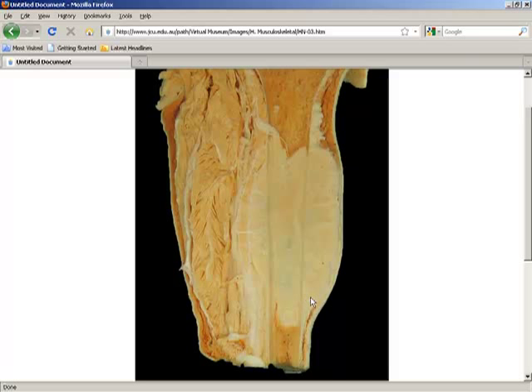Here the tumor is rounded, it's here, very difficult to differentiate, and below is the thickening of the cortex, and that's just a clinical clue that it could be osteosarcoma. Got the point? Any more? Anybody can help me?